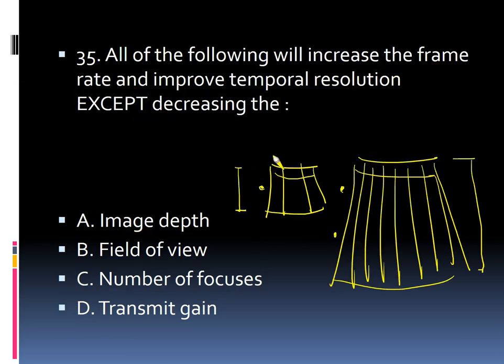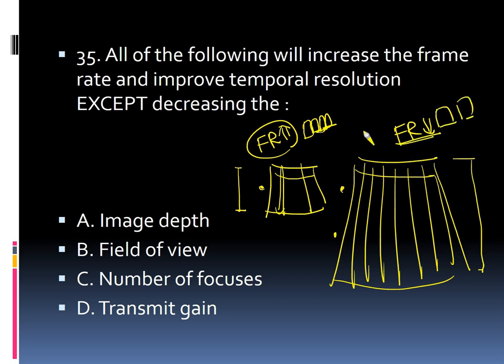If you look at the illustration, this part here shows an image with a high frame rate, and these parts here are in a state of low frame rate. A high frame rate means that the time it takes to create a single image is short. So, in a short period of time, you can produce multiple images. On the other hand, a low frame rate means it takes longer to create each image. So there are fewer images overall.